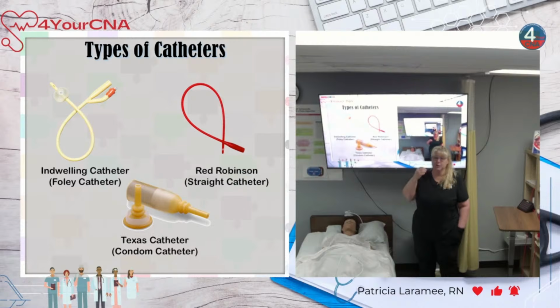Urine is likely to eat skin, especially over 3 days. This is very thin, sensitive skin with high blood flow, which means that you can end up with sores in this area if we don't take really good care of the skin. So that's why we have to take this off every 3 days and do very good peri-care, male peri-care.